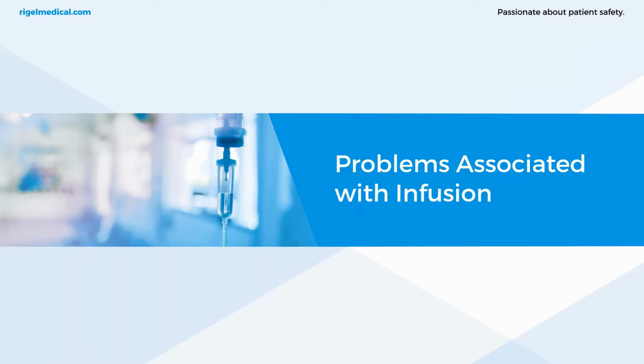So some of the problems associated with infusion, some have already been mentioned here. So occlusion is one. Syringes emptying is an issue. It's a serious problem. Air in the tube.